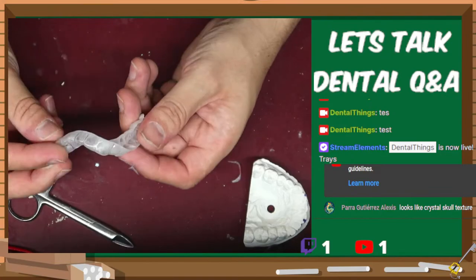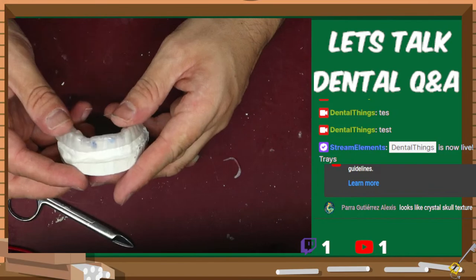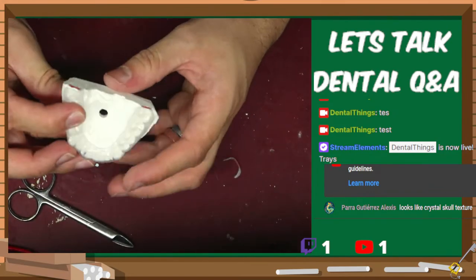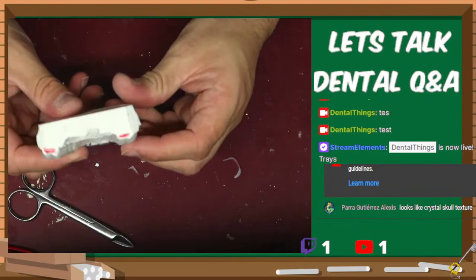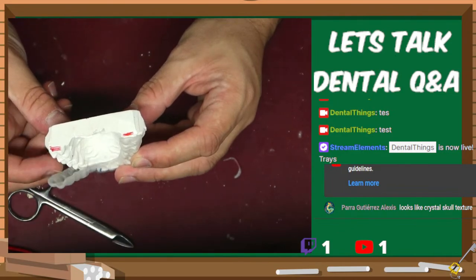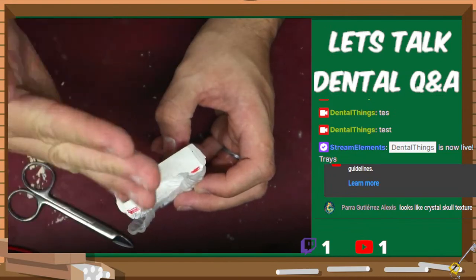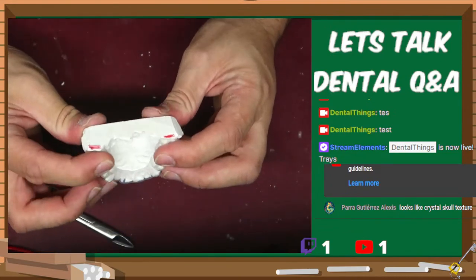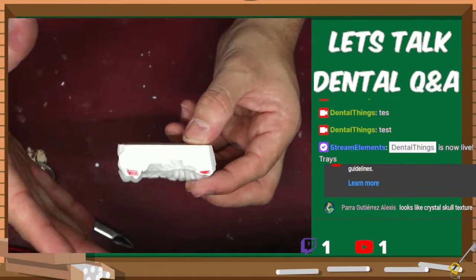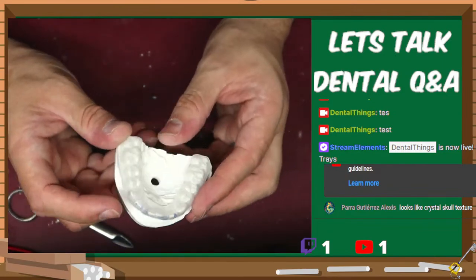Now we're in business. Let's put that back on my model. And while it's on my model, I can make some inspections and see if it fits well. For one, does it come off in one area like this when it's on, saying that something was not tilted right or melted right? But right now, if it's on, it looks like it doesn't lift at all, which is perfect. That means it's fully melted to these teeth. It's fused to this model, which is good.